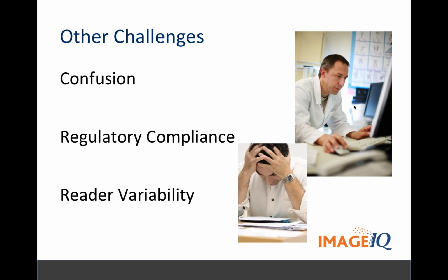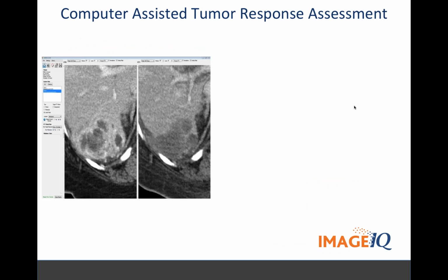So they have different features and functionalities. You're going to see some of that in eMass. Yeah, you really need something that's trained for the actual application. And one of the issues that we'll talk about later is that as you make these measurements, they're not necessarily being put directly into a CRF.